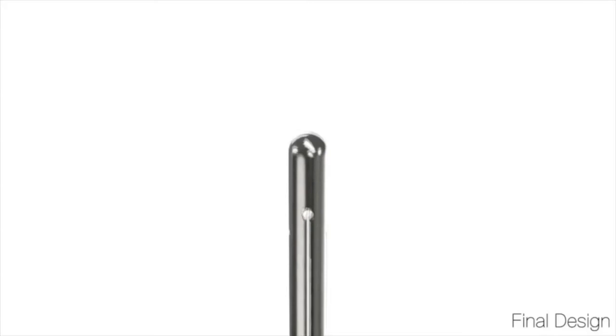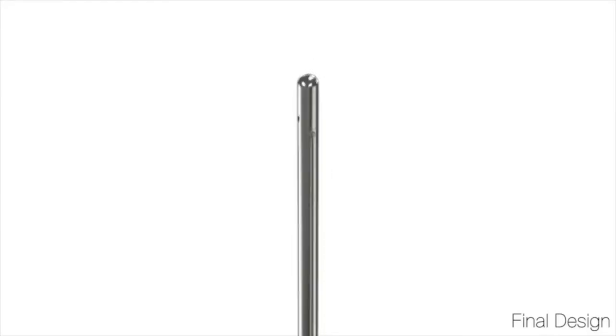In Delft, we manufactured a compliant steerable needle comprising an outer catheter and a steerable inner needle. Here you can see the design of the inner needle. The needle rod is effectively split into 4 quarters. The steerable needle can be actively steered in all directions during an insertion to allow for better control of the needle trajectory. The outer catheter will be left behind in the body, functioning as a channel for radioactive seed placement.